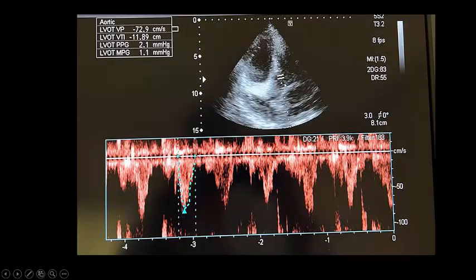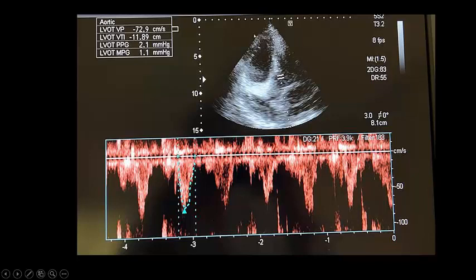We also assessed the LVOT VTI to evaluate stroke volume. Normally it is 18 to 22 cm, but here the LVOT VTI is only 12 cm, indicating low stroke volume. This is consistent with reduced left ventricular preload due to increased afterload on the right ventricle and obstruction of flow in front of the right ventricle. Importantly, if you find a patient with dilated right side and right ventricular pressure overload compressing the left side, you will see fluctuation in LVOT VTI — but this should not be interpreted as a fluid-responsive state.